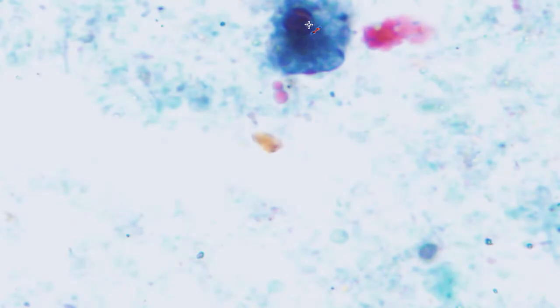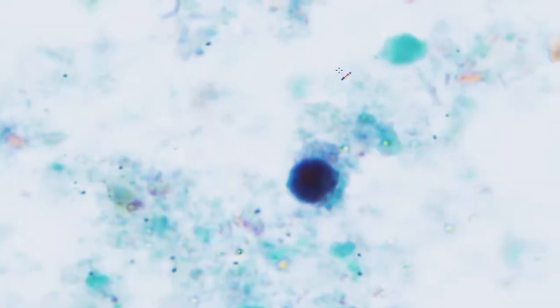Let's try and find another. Remember, I never call it off one particular trophozoite. Here, this one trophozoite has quite a poorly maintained morphology of its nucleus, and I don't think we can really make a call on that one. So that's okay, we keep moving till we find a better one. I never make a call, as I said, off a single trophozoite. I like to see multiple trophozoites before I'm happy to make a call about a species of Entamoeba. Occasionally you may have to, but it's really not advisable if you can avoid it.